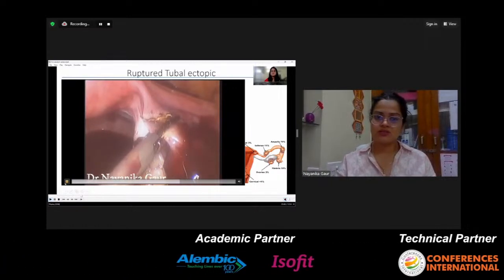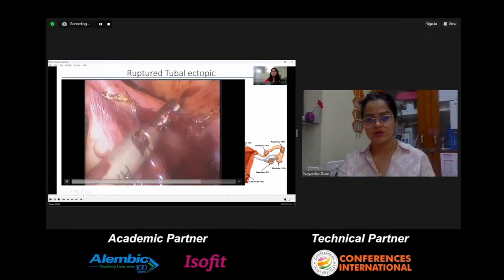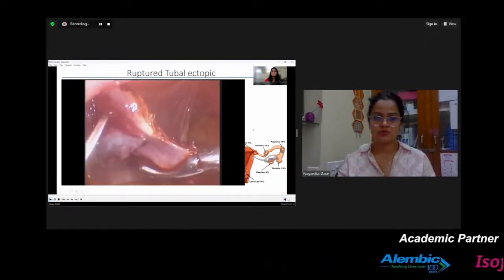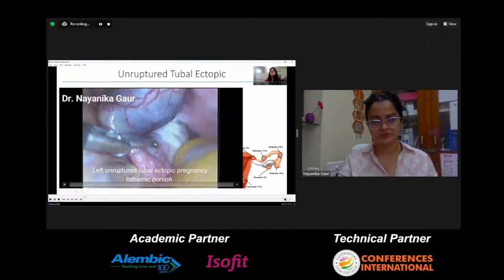Once salpingectomy was done, the ovaries and the tube of the other side were examined, and they were found normal. These patients do conceive normally with a single tube also.